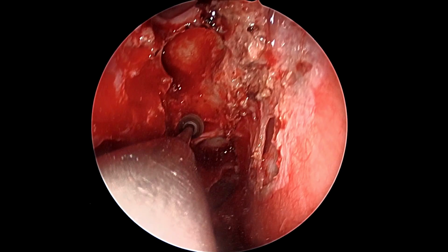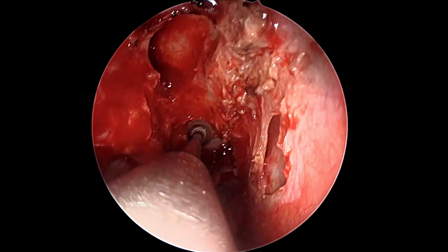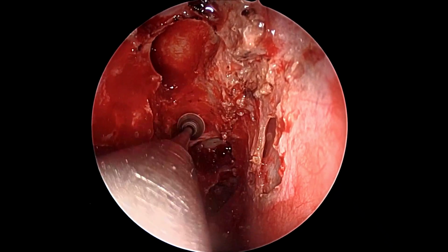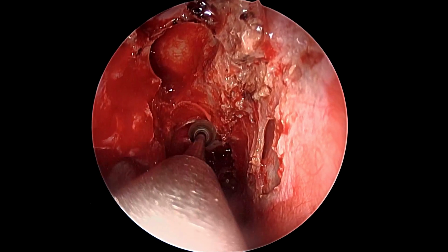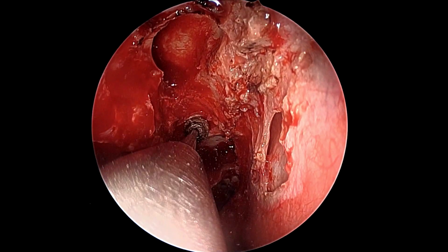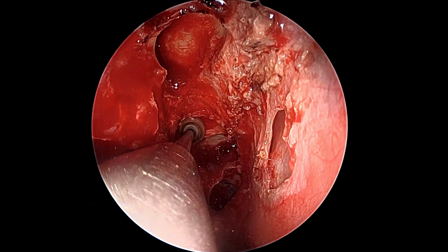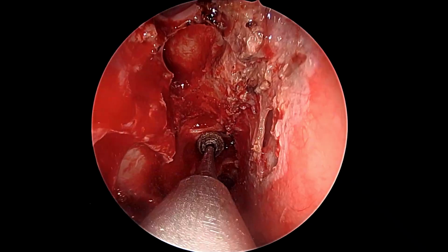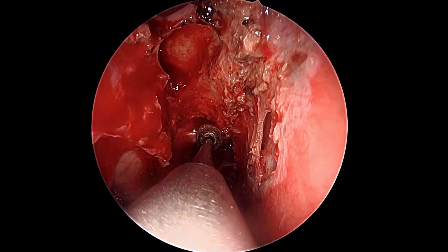So posteriorly, in the mucosa like you see here, we flatten the base of skull even more, and now all the erstwhile partitions that we were seeing before have been taken down. The bone from the entire middle and the posterior ethmoidal cavity looks much more flat and receptive for graft placement.